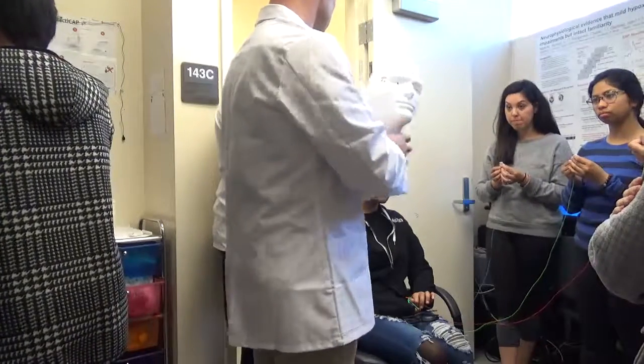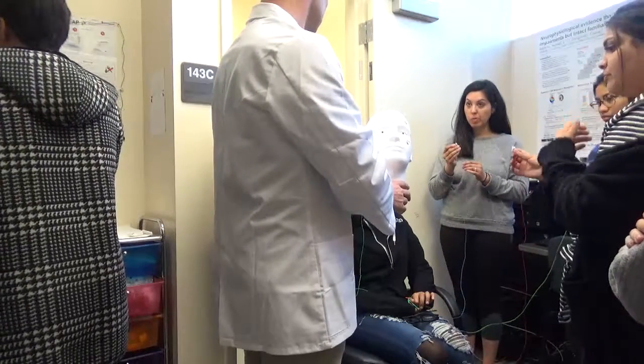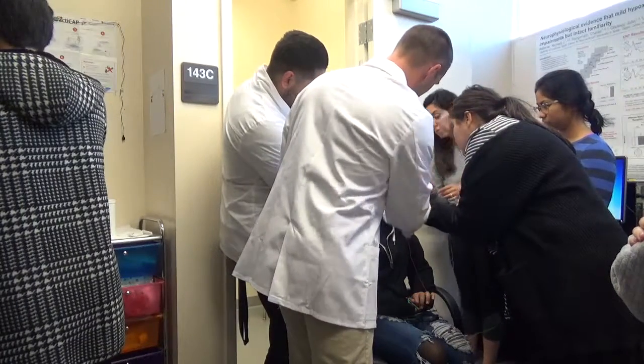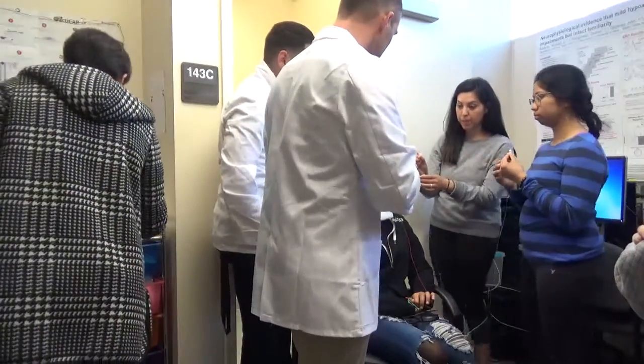And then you take the sticker off from this side? Yeah, but under the cap. You already put it on there. I was just going to leave it on. Yep. You put the gel on top of the electrode and then the sticker on top of the gel.